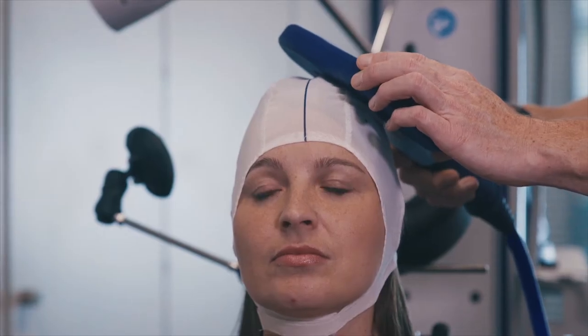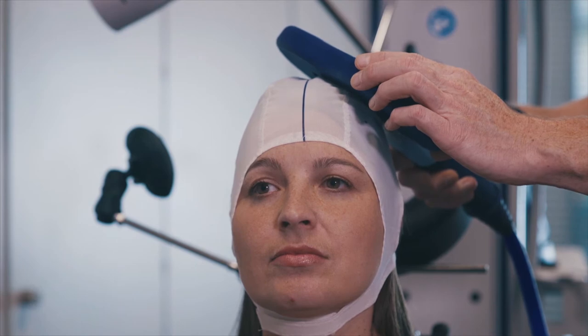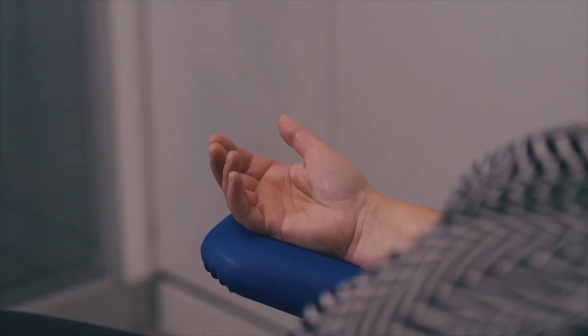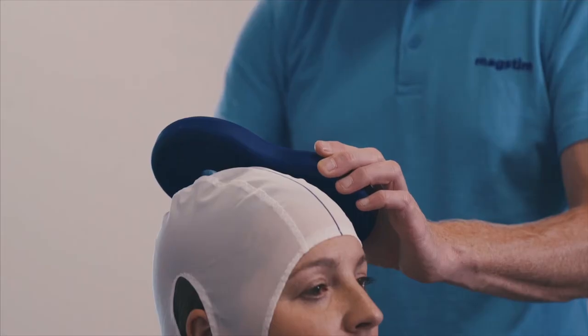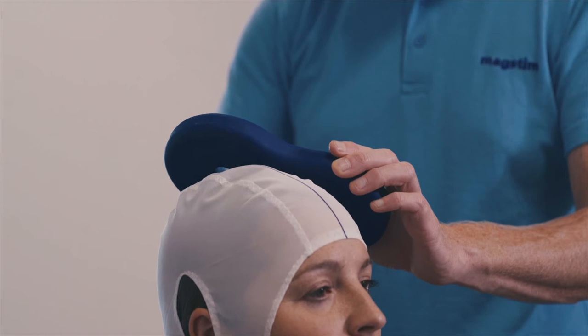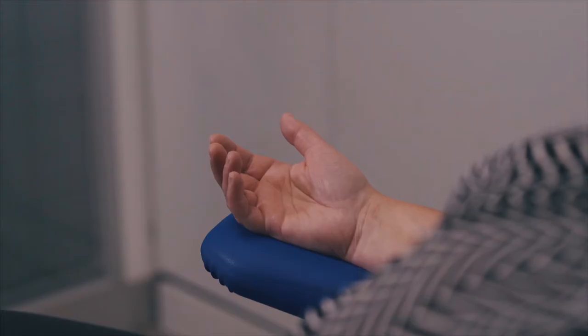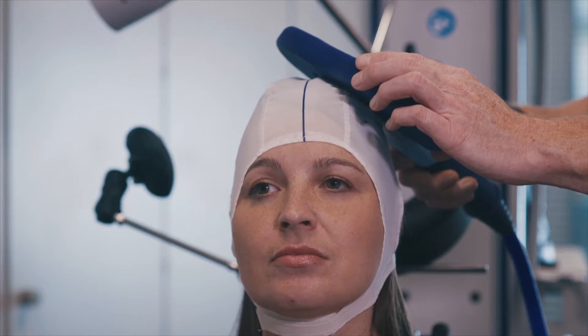With the optimum power found, from C3 move the coil one centimeter towards CZ and deliver a pulse. Make a note if the twitch was larger than at C3. Now move the coil one centimeter left and make a note if this is the largest twitch yet. Continue to move and pulse in this grid-like pattern for at least 9 points. Mark the point of the largest twitch as the hotspot, or HS.